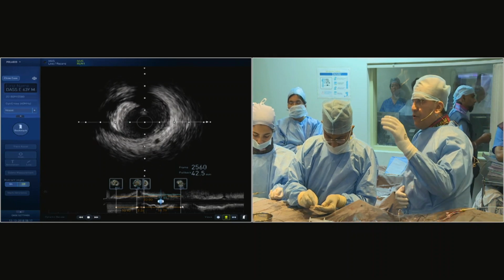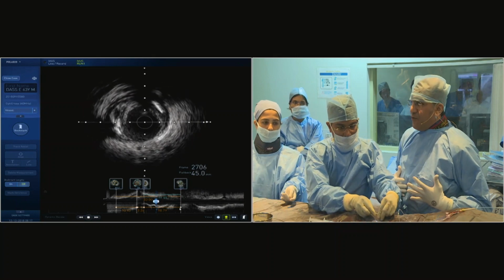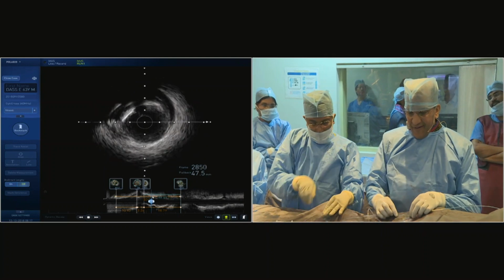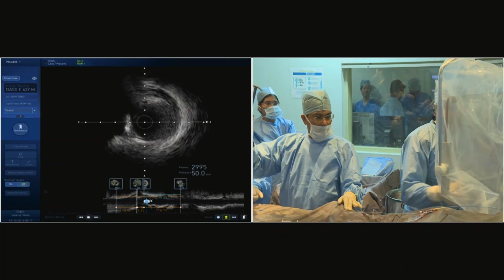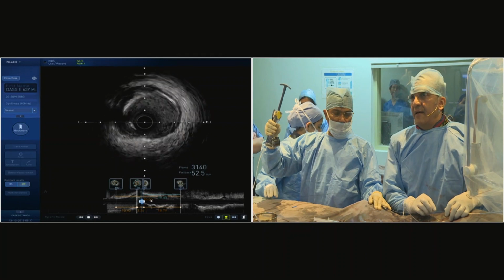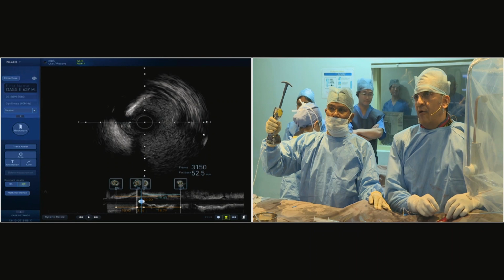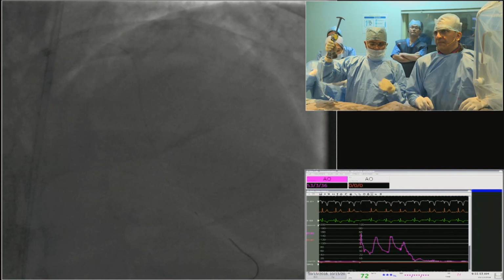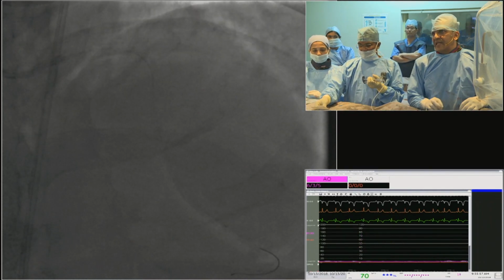And when you don't see so much plaque, I'm going to try and keep it simple and do what I would do in my daily practice. So what is your plan? How are you preparing the lesion? I like to put in a cutting balloon if I can, likely to not slip, and then dilate this lesion gently to complete expansion. I see a little bit of calcium across the lesion, but nothing really significant.